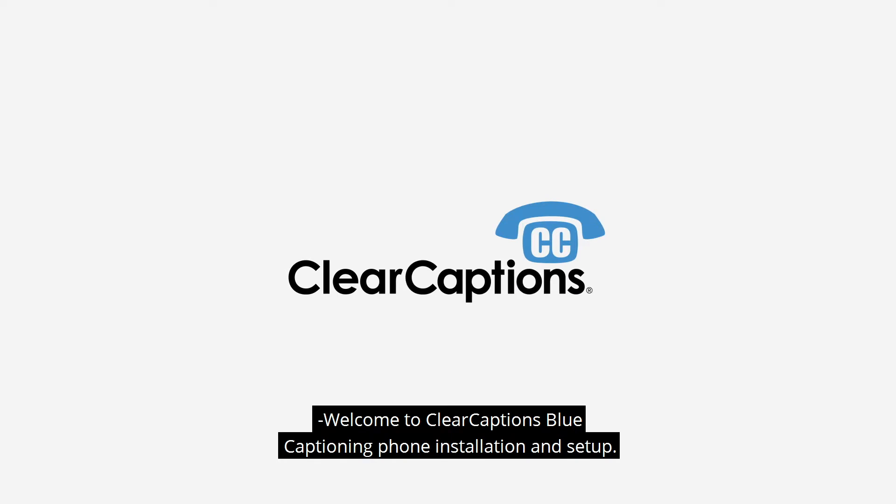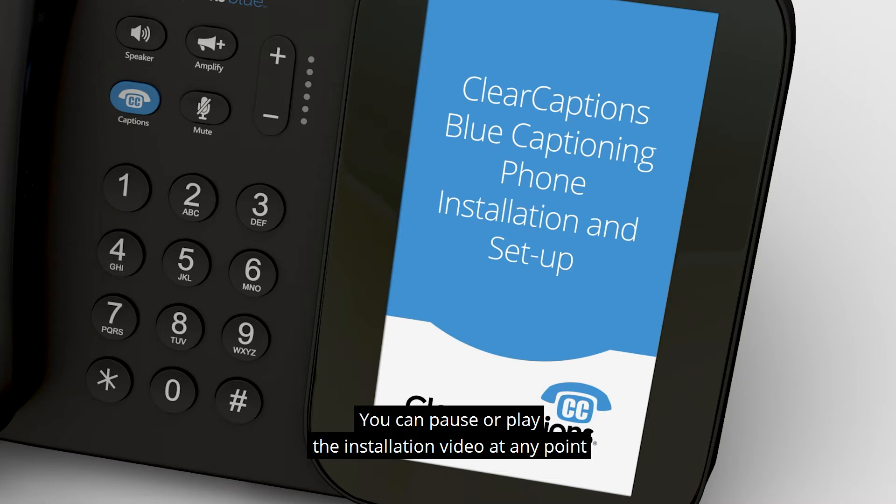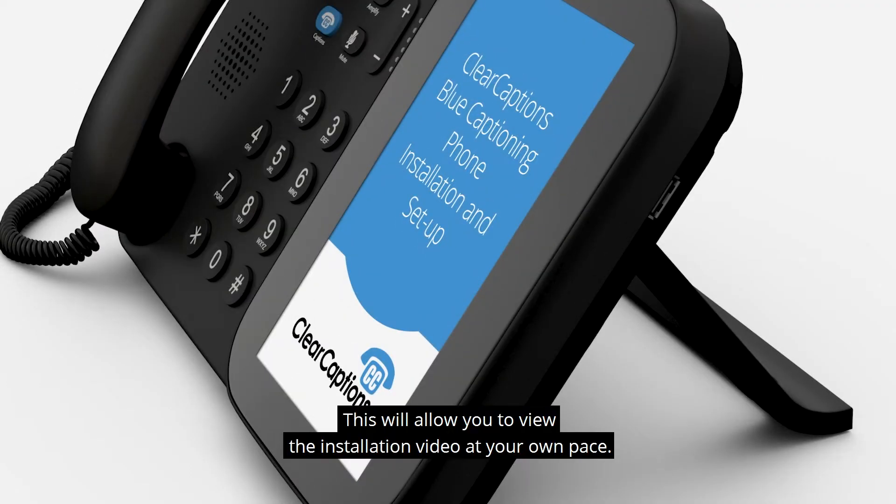Welcome to Clear Captions Blue Captioning Phone Installation and Setup. You can pause or play the installation video at any point using the controls at the bottom of the screen. This will allow you to view the installation video at your own pace.